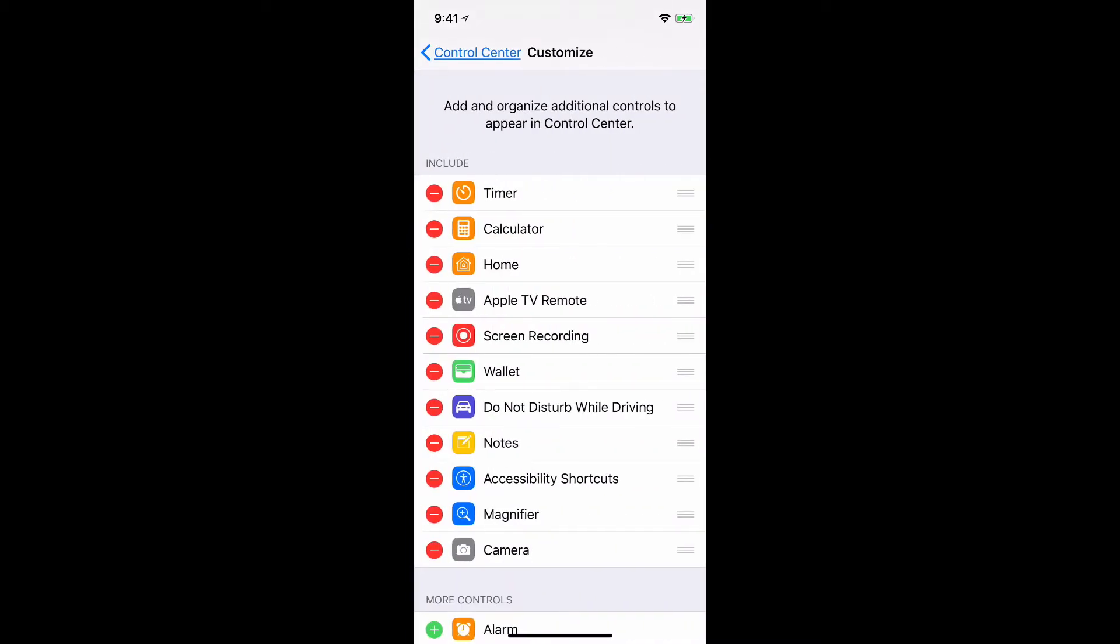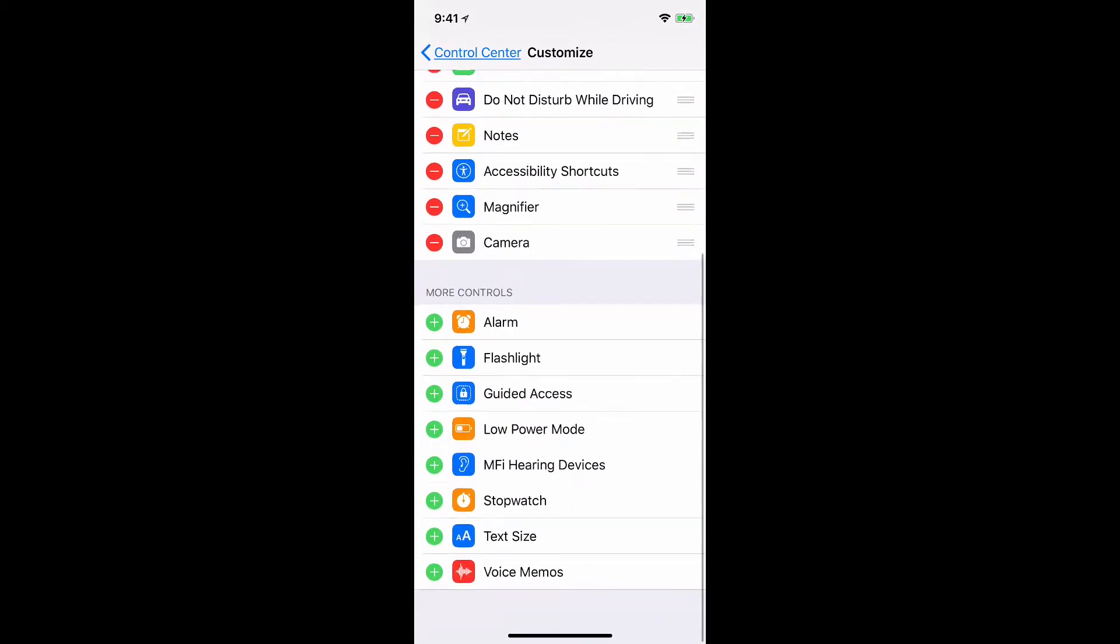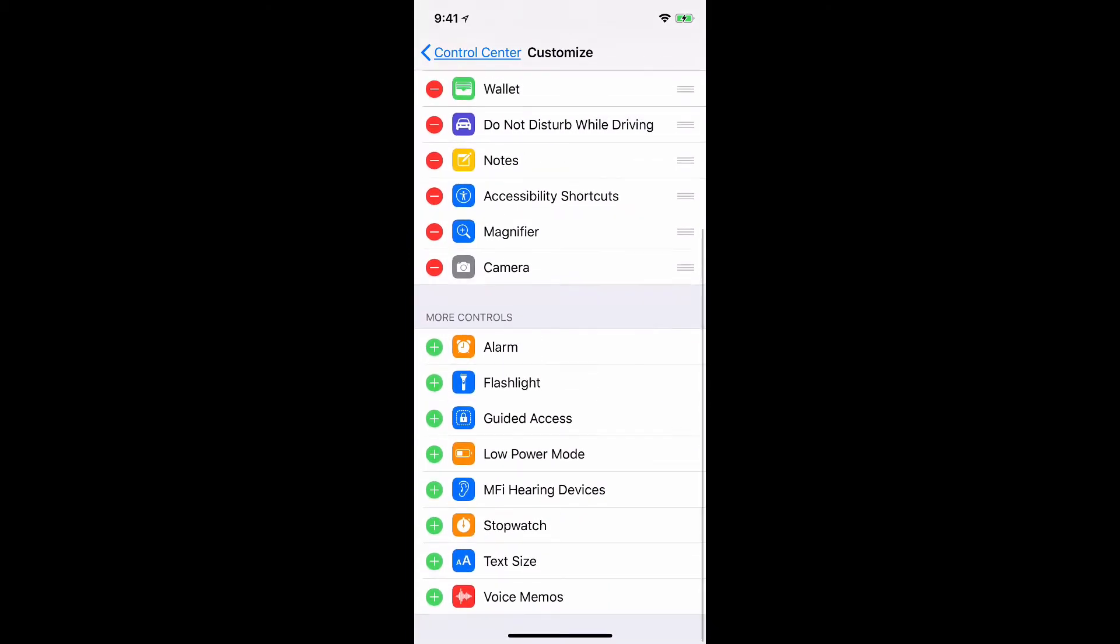Here what I need to do is go to the list at the bottom of things that are not currently in my control center. I'm looking in this instance for MFI hearing devices and I'm going to add that by clicking the green plus.